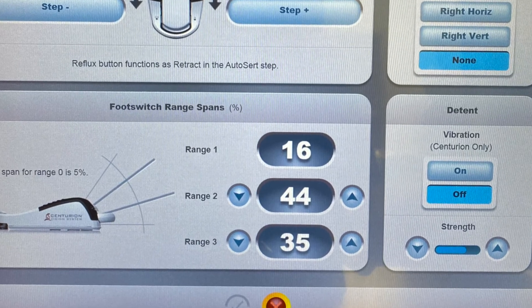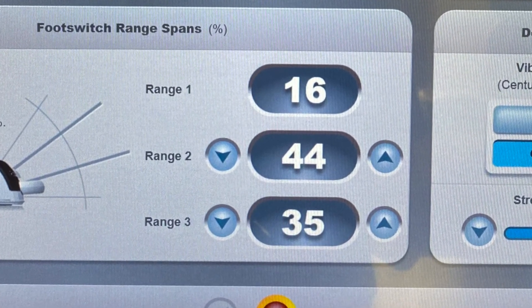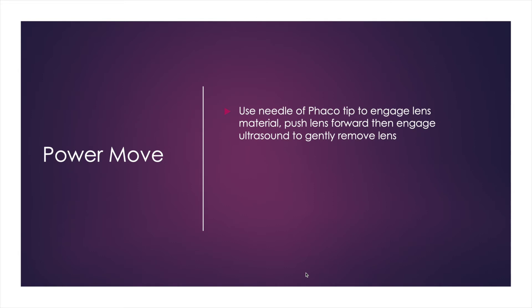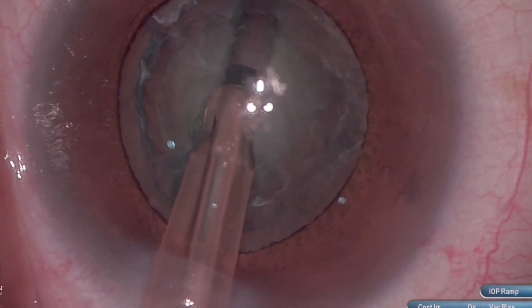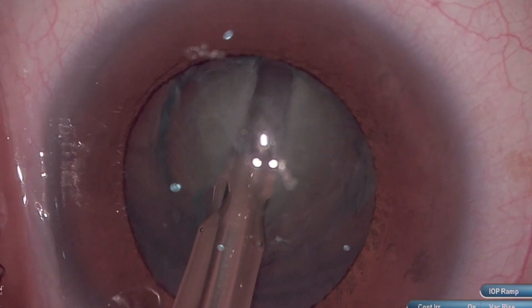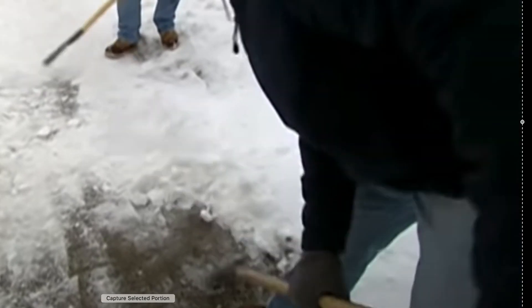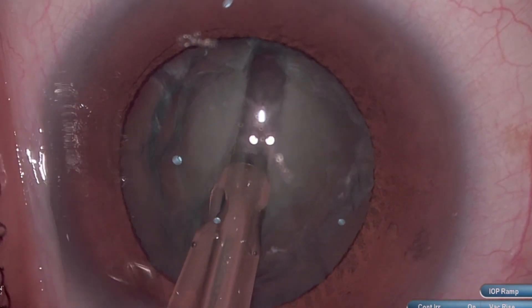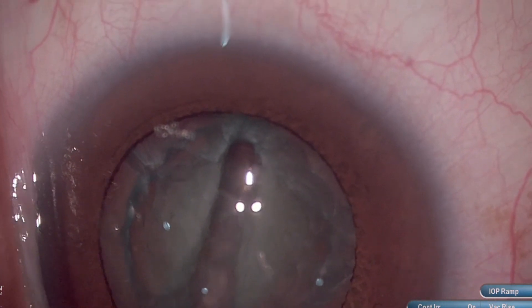I'm using the knowledge of my FACO settings and foot position during sculpt, just as I'm visualizing the 3D version of the lens during creation of the groove. A lot of times during cataract surgery you need to sculpt deeper to be able to crack—this is a technique called the power move. During middle third sculpting, I keep my tip as flat as possible but actually engage the needle of the FACO tip and lift it up to scrape—like scraping ice off a sidewalk, the tool can't go through the sidewalk just like you can't go through the posterior capsule. So I'm flat with my FACO tip but pushing with the needle, almost lifting at times, applying just enough FACO energy to emulsify a millimeter deeper.